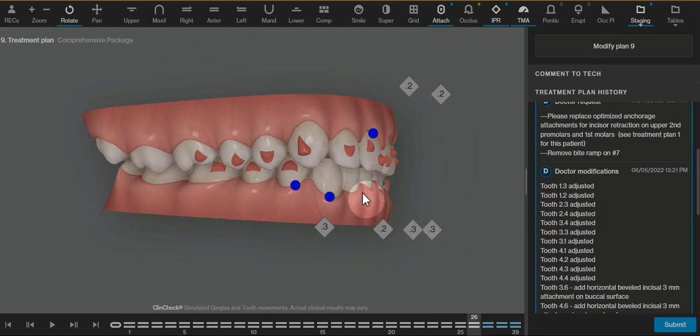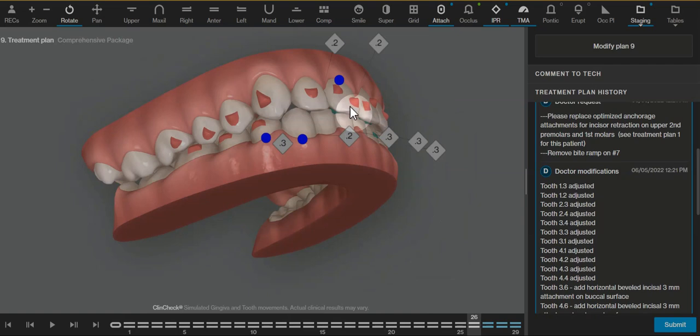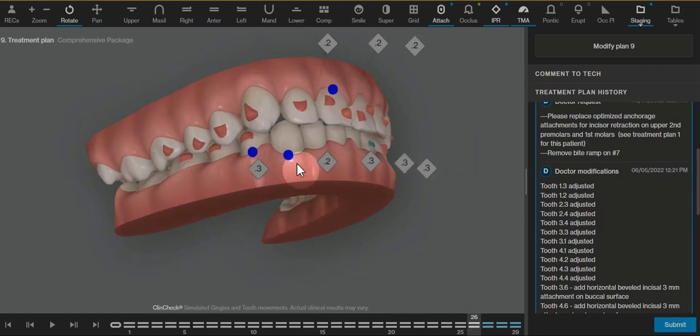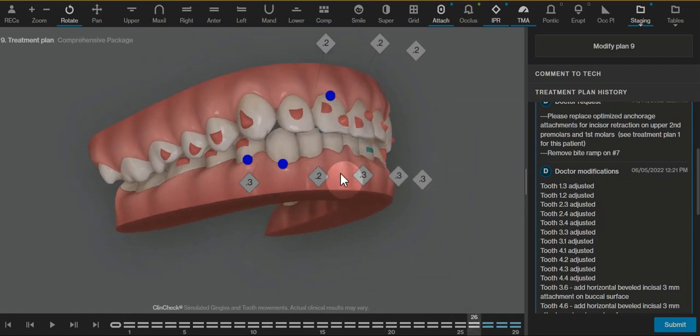And that can happen if the overjet was set too tight and there wasn't enough space for the teeth to interact with each other, because the teeth clinically are always going to finish a little bit differently than what we show on the ClinCheck.